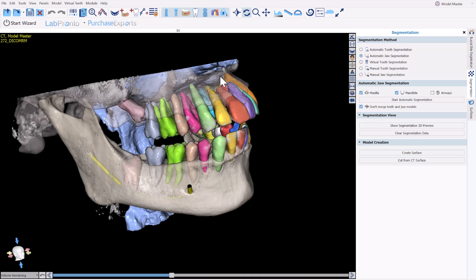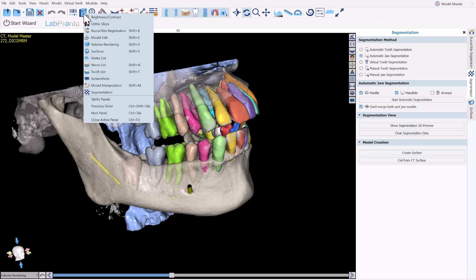Within our surgical guide, crown and bridge, and denture modules, the functionality can be accessed via the segmentation panel in the model master module. If it's not open in front of you, the segmentation panel can be accessed simply by going to the panel drop-down and choosing segmentation.